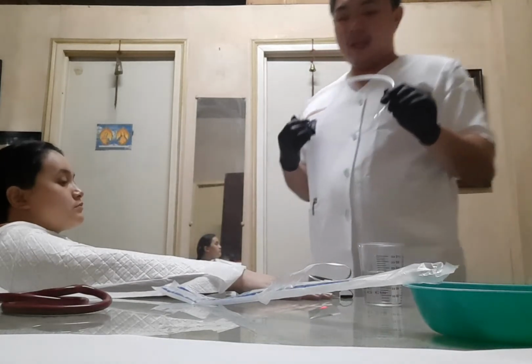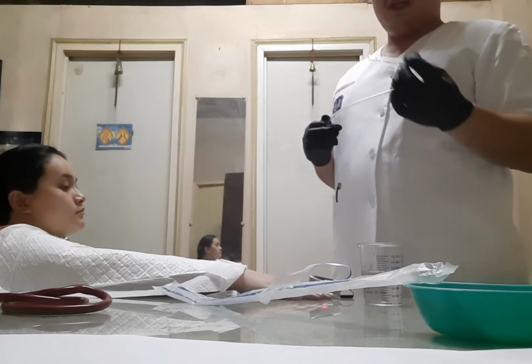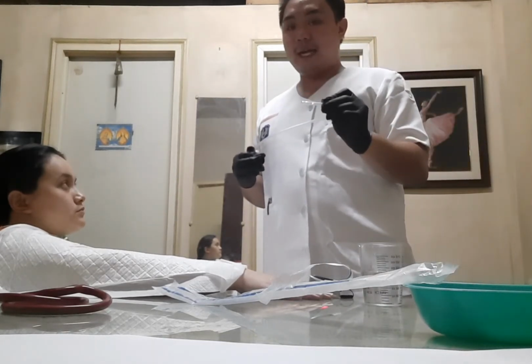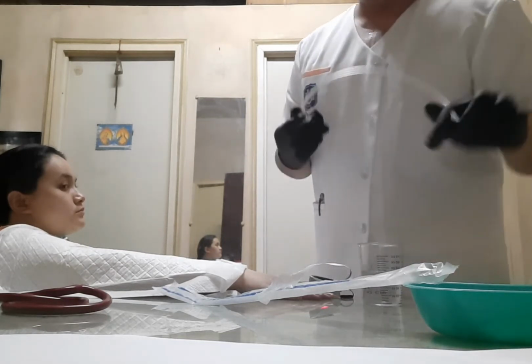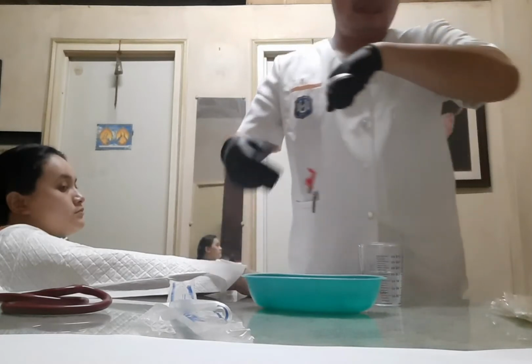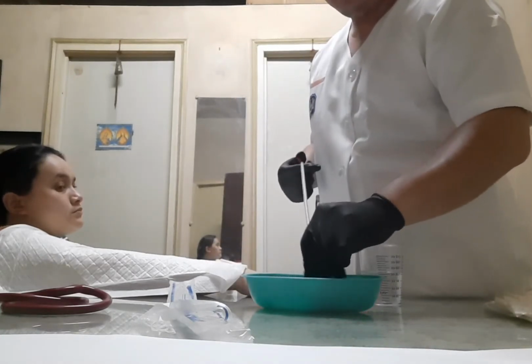Now, before we suction, we will apply the water-soluble lubricant, assuming that this is the water-soluble lubricant.